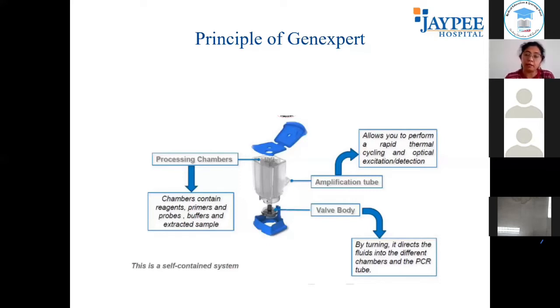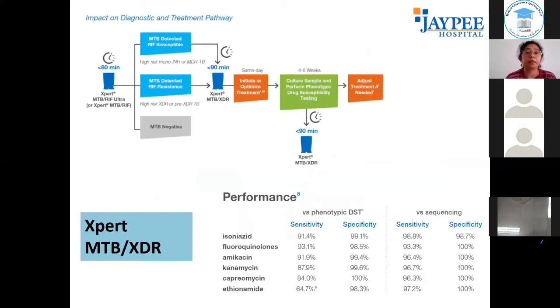As the sample moves, you load the sample and it goes into the chamber, and the dehydrated reagent which is there moves along with that. So this is a very compact thing. You load this onto the instrument, it goes into the thermocycling phase, and then you're able to see the PCR. And the advantage here is it is not an endpoint PCR. It is like a real-time PCR. You can see a graph and see what has happened during the PCR.